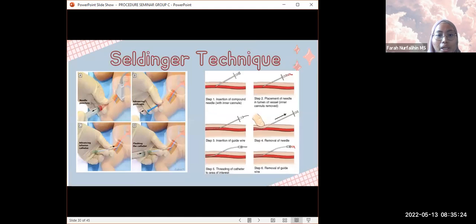Okay, why do we need a sterile Seldinger cannulation set? Because we'll be performing the Seldinger technique. This technique allows the insertion of a catheter larger in diameter than the needle originally utilized. So these are the steps of inserting the central venous catheter using the Seldinger technique.